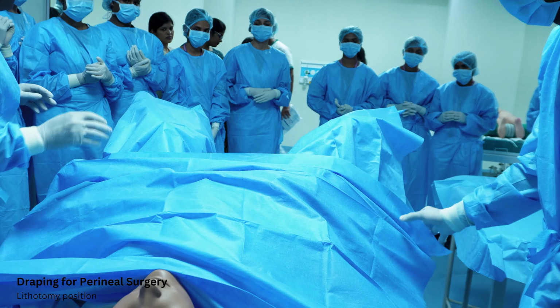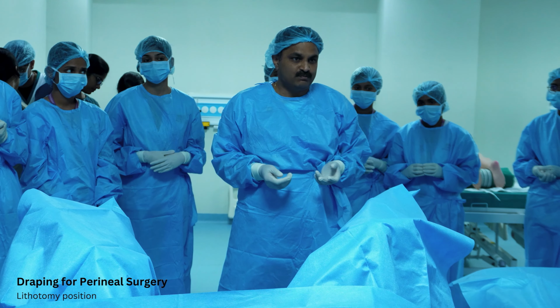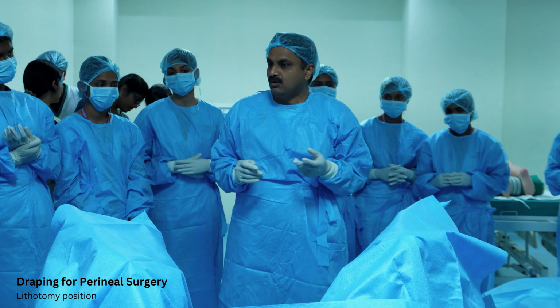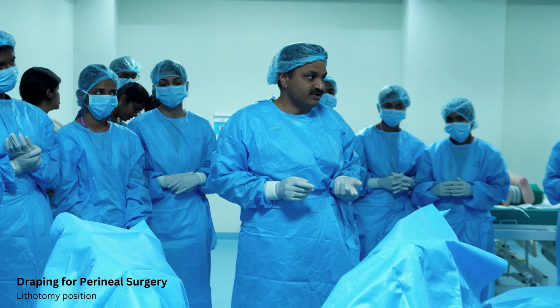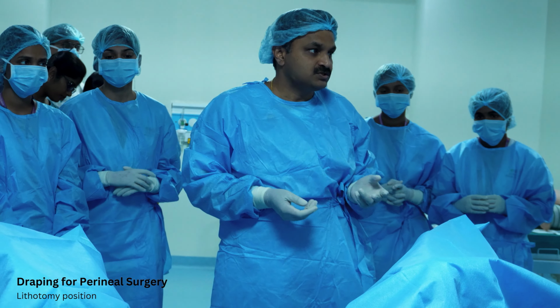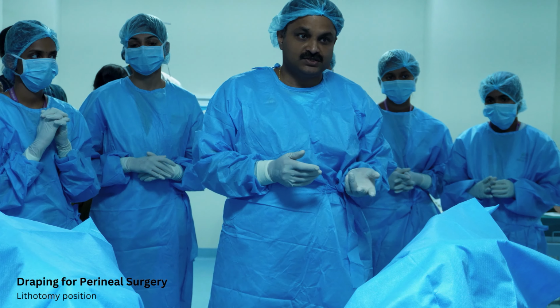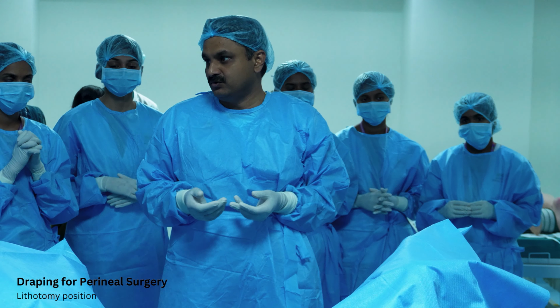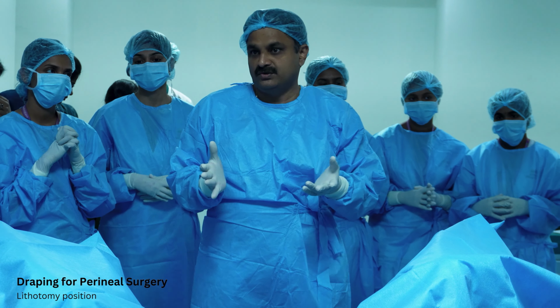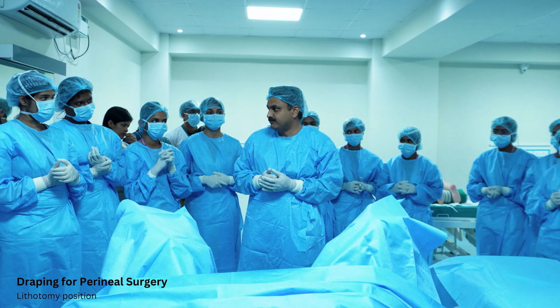That's fine. Thank you. So this is the draping for cystoscopy, ureteroscopy, or even if you want to do some anal surgery or TURP. All these procedures, or insertion of a stent into the ureter or removal of a stent, then TURBT, that means transurethral resection of bladder tumor, or transurethral resection of prostate gland. So all these things you can do. Even for a DNC procedure, and even some surgeries in the anal area, you can go for the same type of draping.